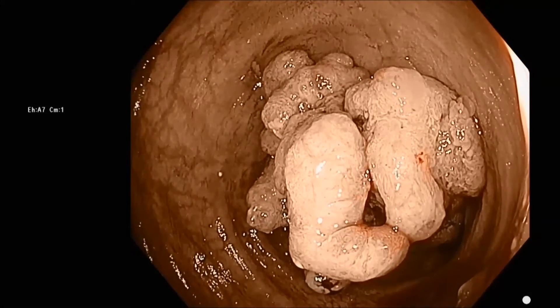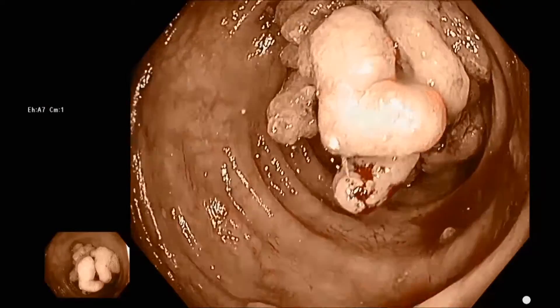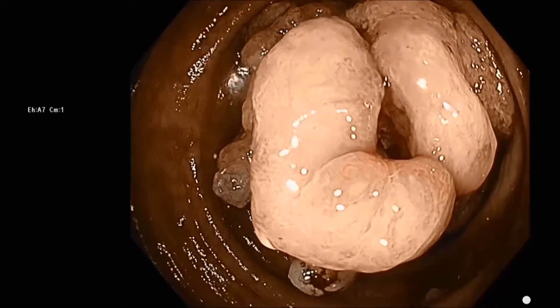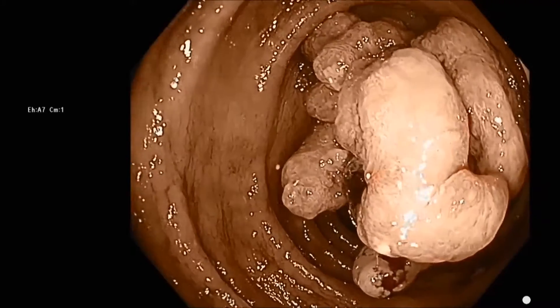For demonstration purposes, I'm going to demonstrate the bleb technique, but I'm going to make the blebs with the solution I was using to perform EMR on a lesion proximal to this tumor.